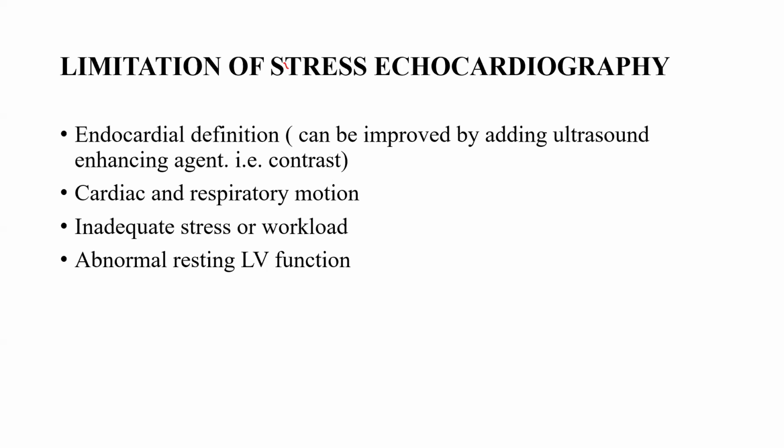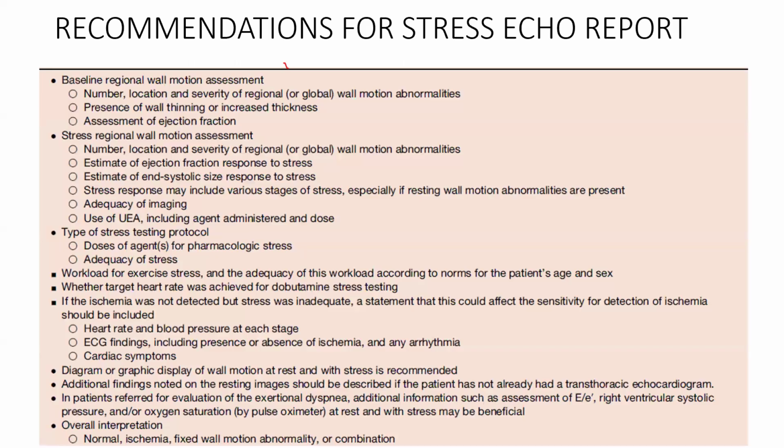And if the patient already has an abnormal resting LV function, it makes the interpretation of regional motion a bit more challenging than usual. Now, how do you report it?